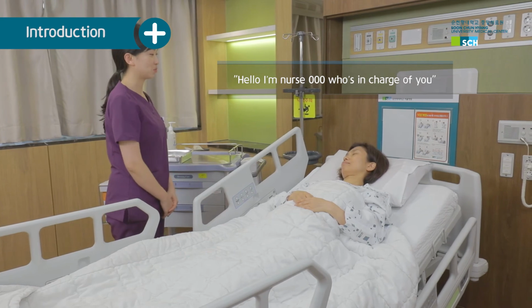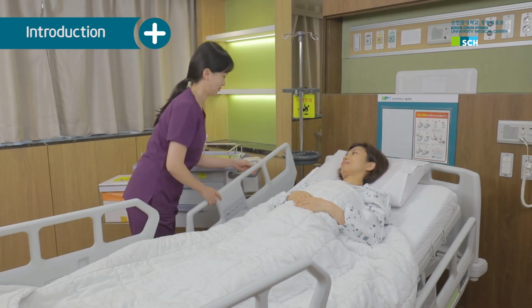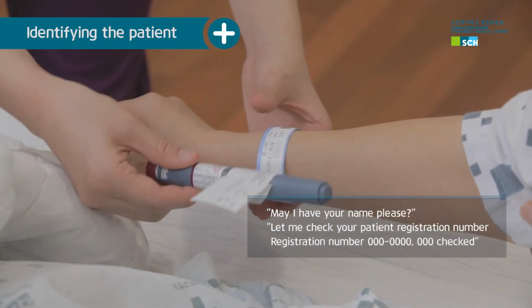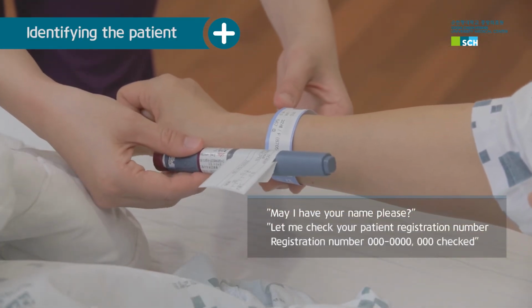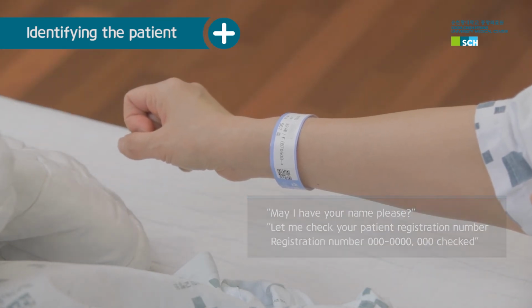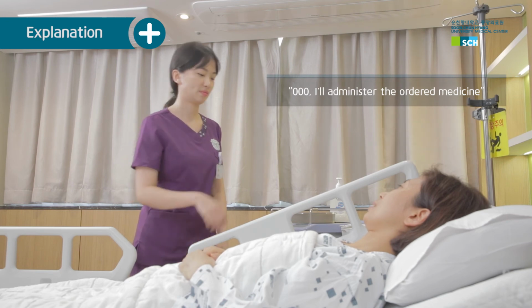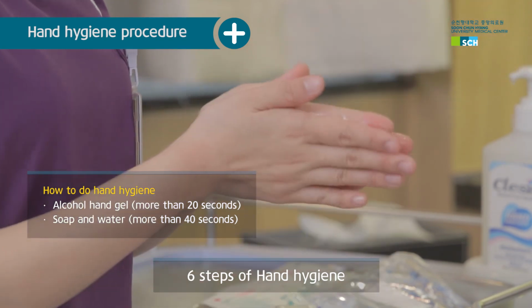Introduce yourself to the patient and identify the patient by asking the patient to state his name. Check the patient registration number and name by comparing the patient's ID wristband with the label on the medicine to be administered. Explain the purpose of the injection, the effect of the medication, and precautions to the patient. Perform hand hygiene.